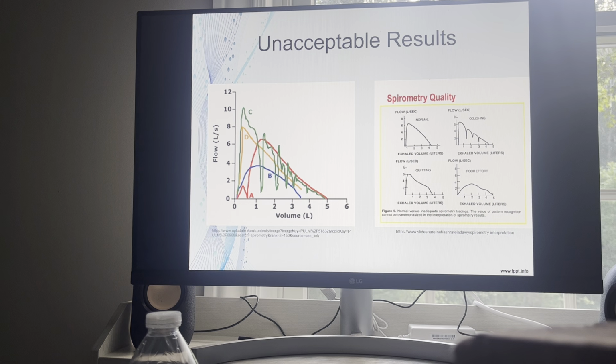There's some medical techs that do this, and they put their all into it. You can hear them down the hall coaching their patient, blow, blow, blow, keep blowing, keep blowing. And you're like, okay, that's going to be maximal effort. But let's look at the chart or the graph or whatever on the left.